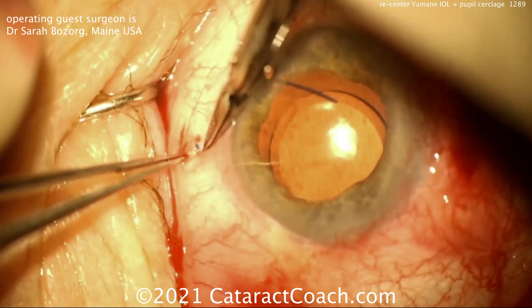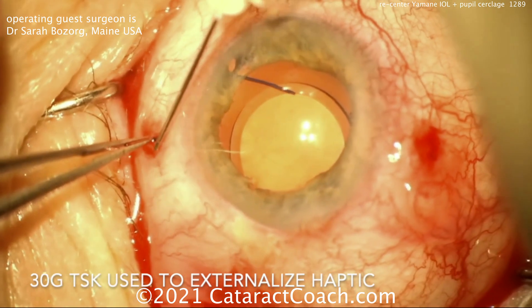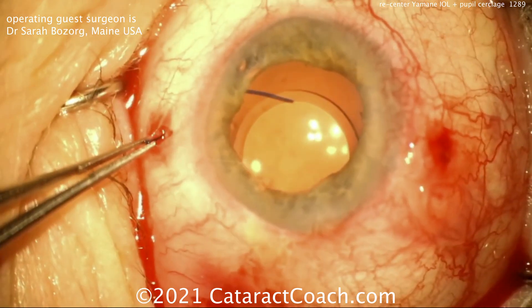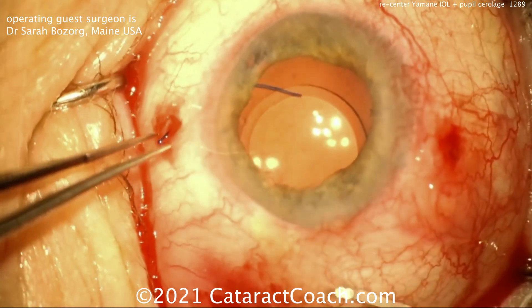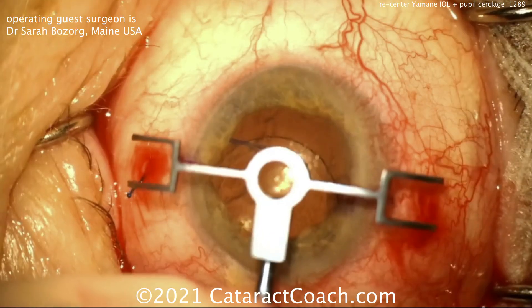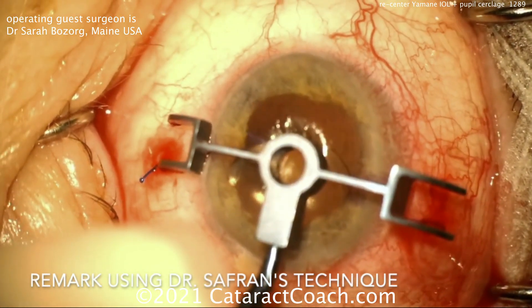Dissecting out that one tip of the IOL haptic, using that small 30-gauge needle to help really externalize that haptic a little bit more. This patient had a full pars plana vitrectomy already, so the good news is you're not going to entangle any vitreous. The bad news is you could drop the IOL on the macula in a second.